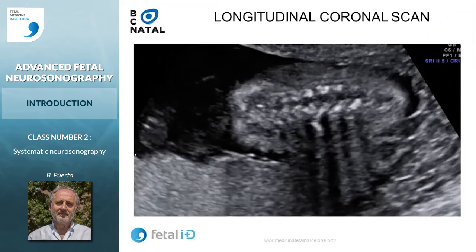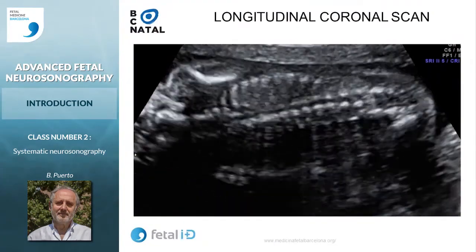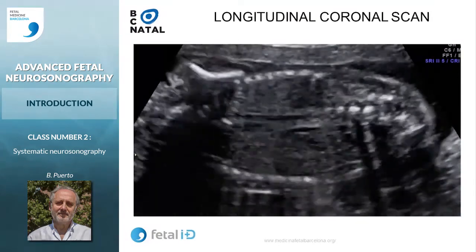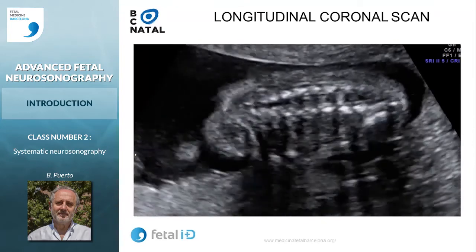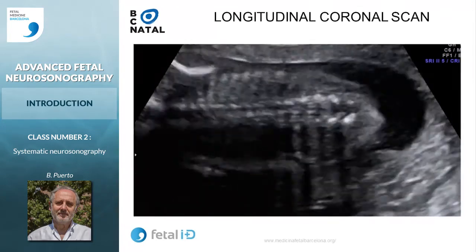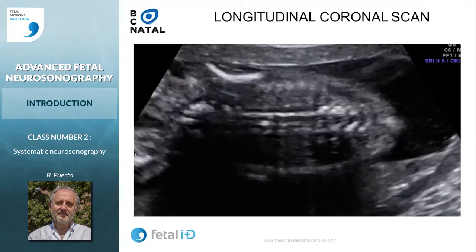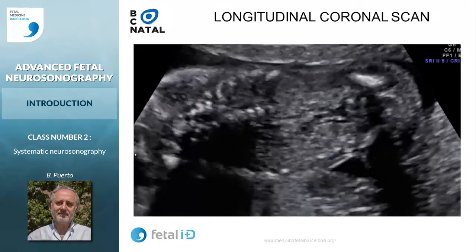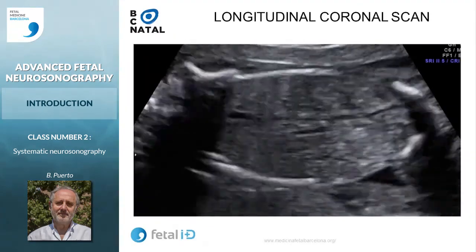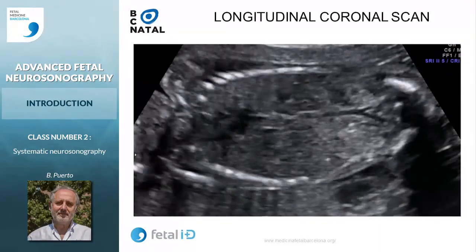We should complete the evaluation with a coronal scan and axial scan. In the coronal scan, the middle line corresponds to the vertebral bodies, and the lateral ones correspond to the lateral processes. In this case, they converge at the sacrum. A dilation of the lateral processes should claim our attention. We can also suspect the presence of hemivertebrae or scoliosis.